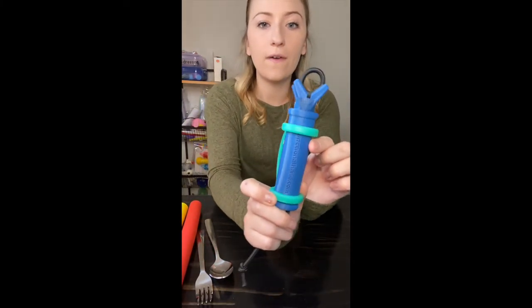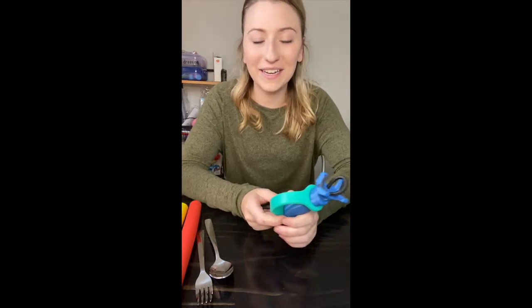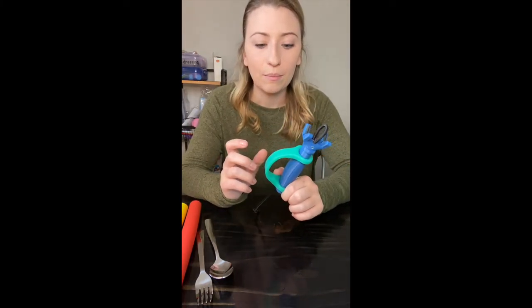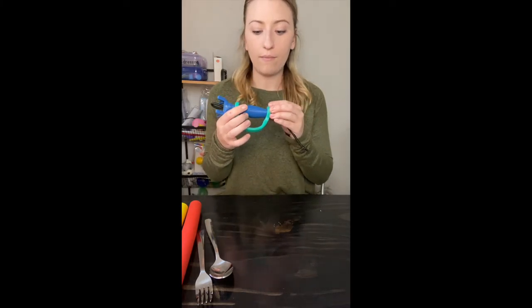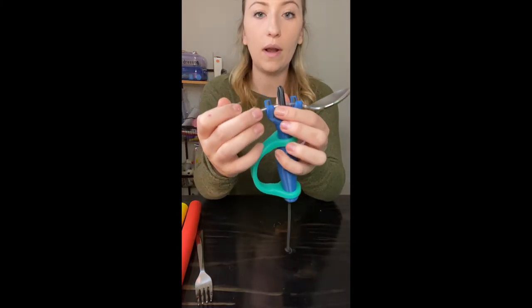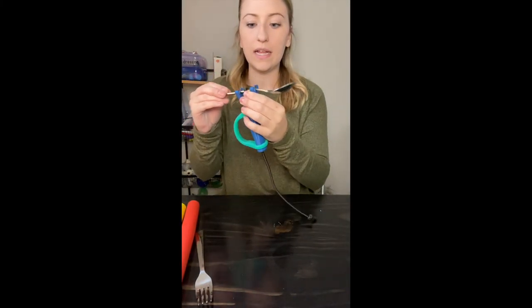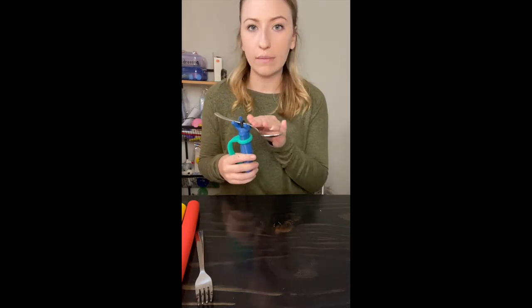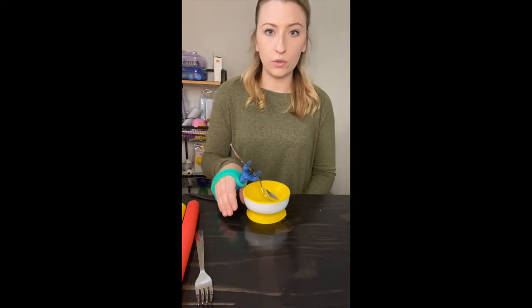I've shown the Functional Hand before — this is the blue piece — and this one already has the Easy Hold on it. I love these two pieces together. If you just put a spoon in here, whatever utensil you're using, you pull the bottom part, loop it, and then pull it all the way to the side so it's not going anywhere. It gives more stabilization and a longer lever arm to be able to use. You can just scoop this way.